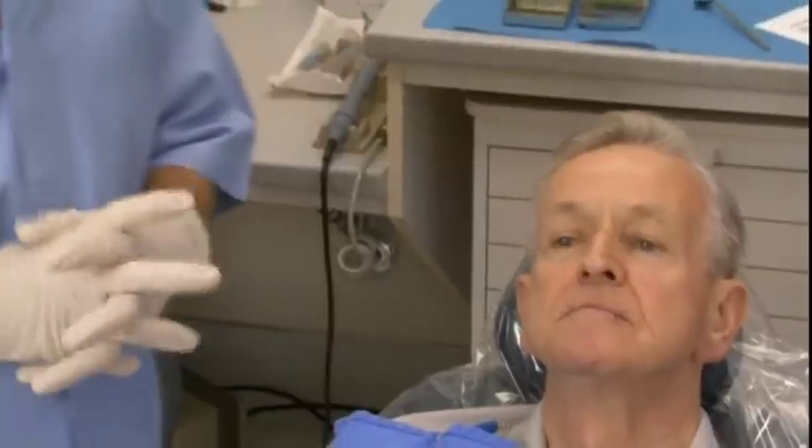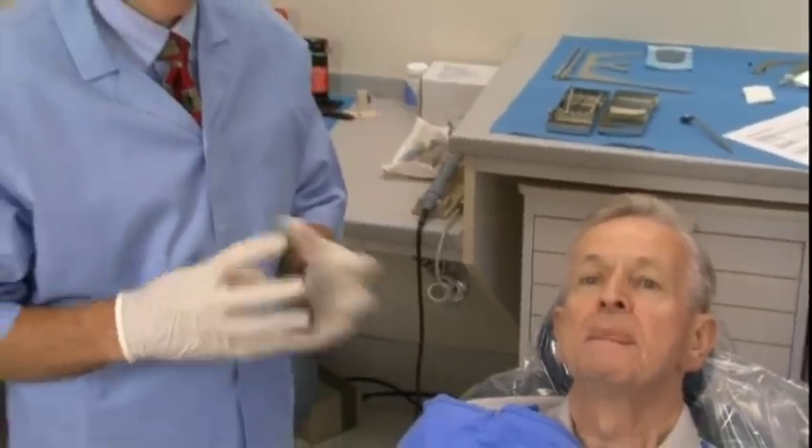The next thing we're going to do is take some impressions of Mr. Bothy and start the process of making his new denture.